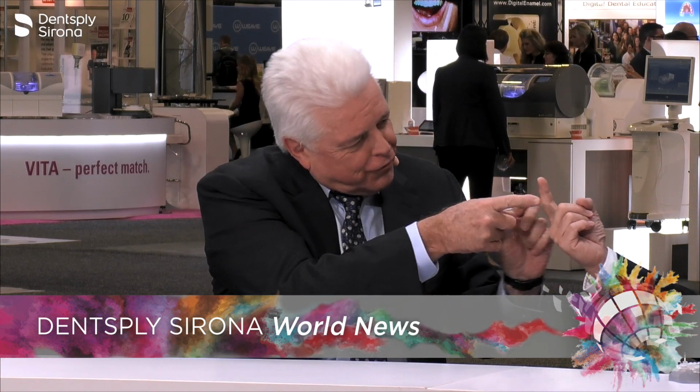So if we had sleeve guides that could take us directly to the root, we would not only preserve bone, but we could be more precise in our apicoectomy and our retrograde procedures. So I would think there could be quite an application in surgery, and we do a lot of surgery in the field of clinical endodontics.